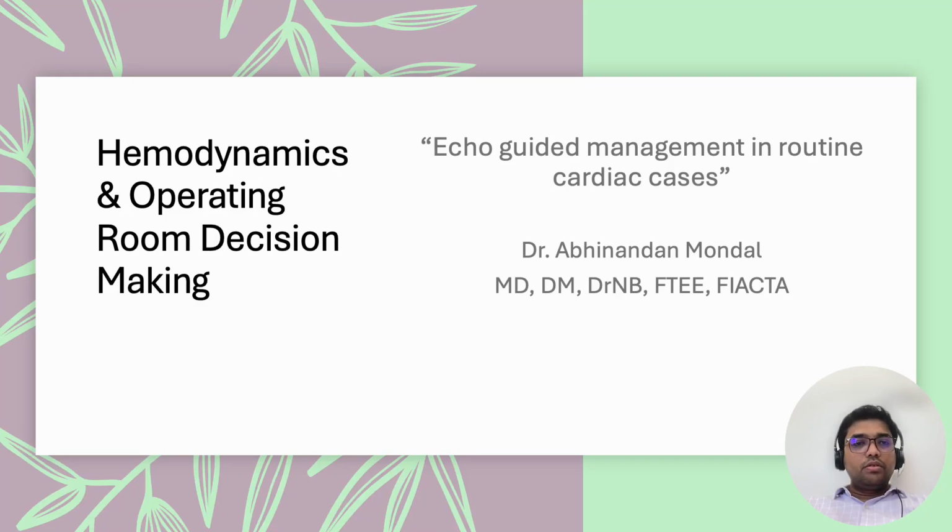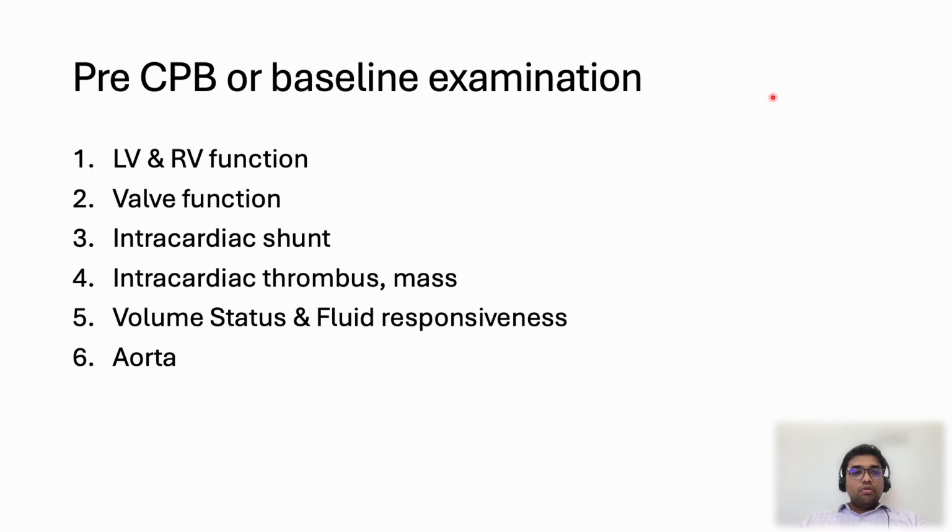Hello everyone. Today our topic of discussion is hemodynamics and operating room decision making, and how TEE can help to manage your routine cardiac cases. So in the pre-CPB or baseline examination, the first thing you will have to see is how the LV and RV are doing.